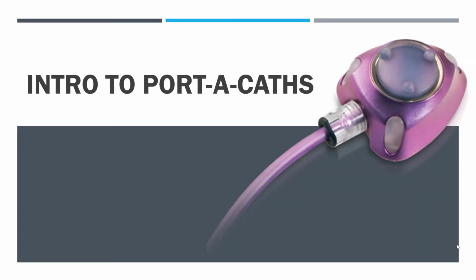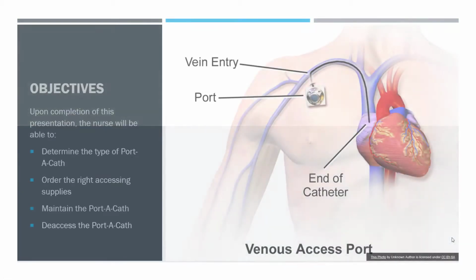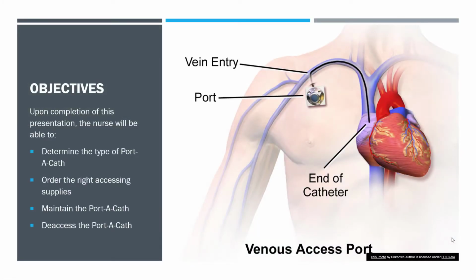Welcome to Introduction to Portacaths. The objectives that we'll learn today are to determine the type of portacath, order the right accessing supplies, maintain the portacath, and de-access the portacath.